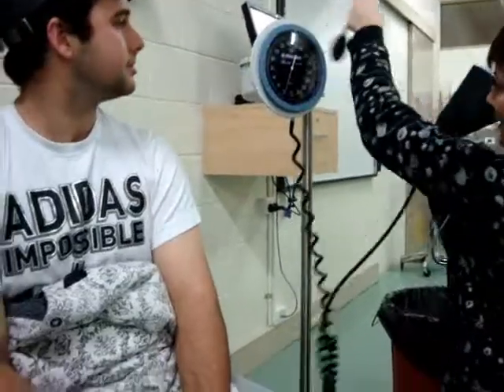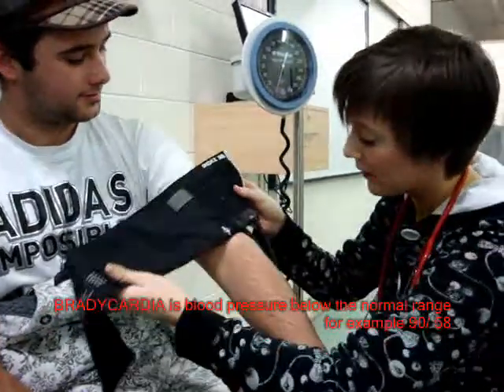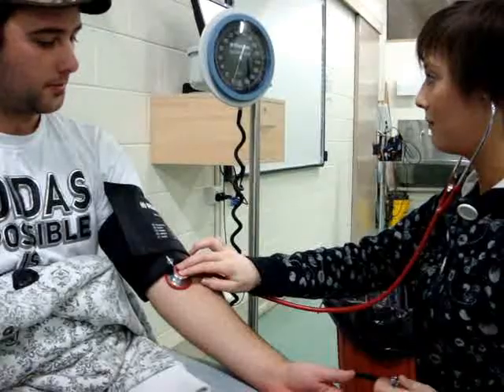To take a patient's blood pressure, place the cuff around the arm and ensure the line is on the brachial artery. Place your hand on the radial pulse and pump until you can no longer feel the radial pulse. Then release the pressure.